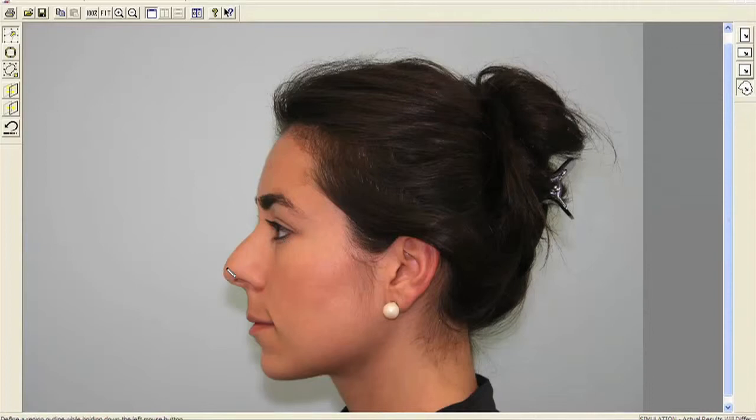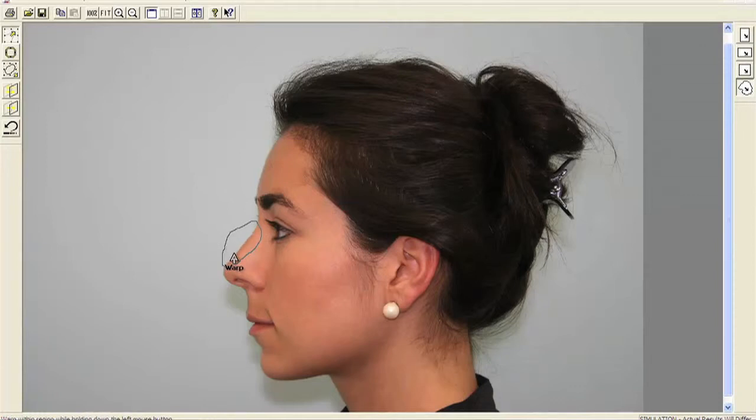I think the bridge needs to come down to the point that it's a little straighter. So this is her with a straight bridge.